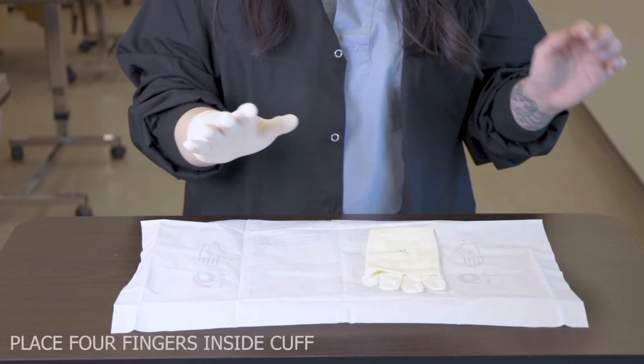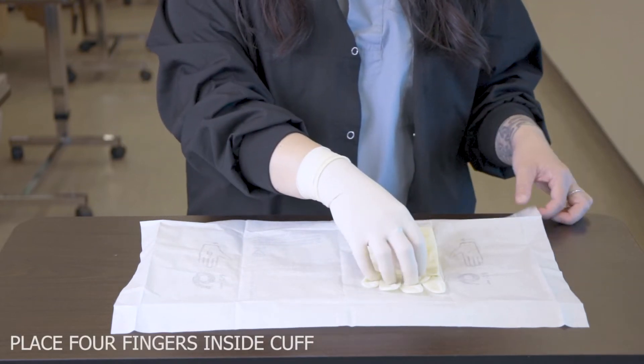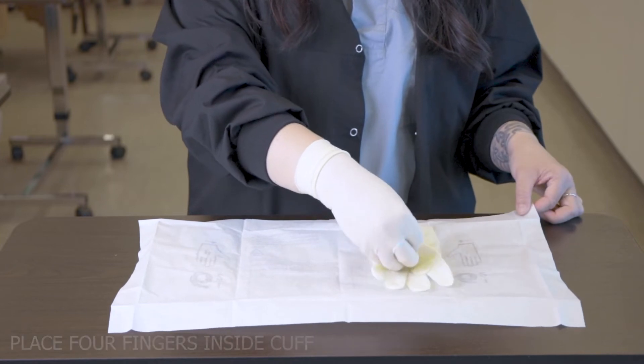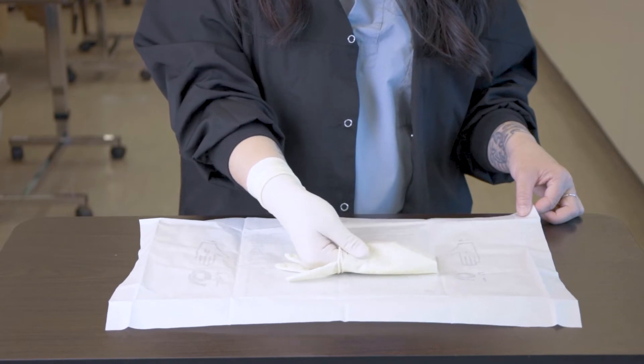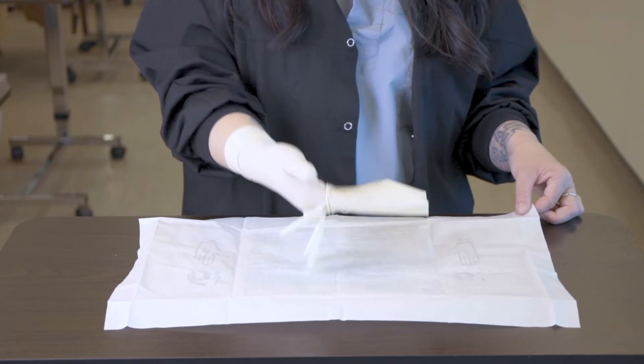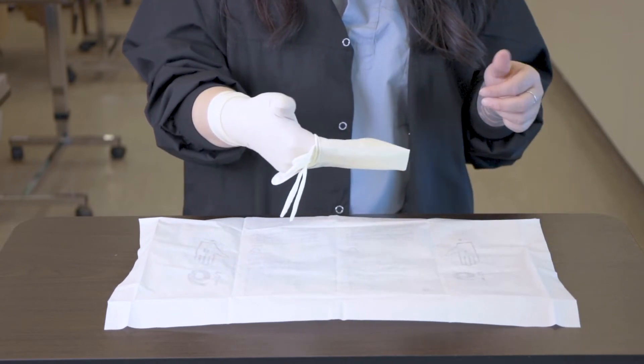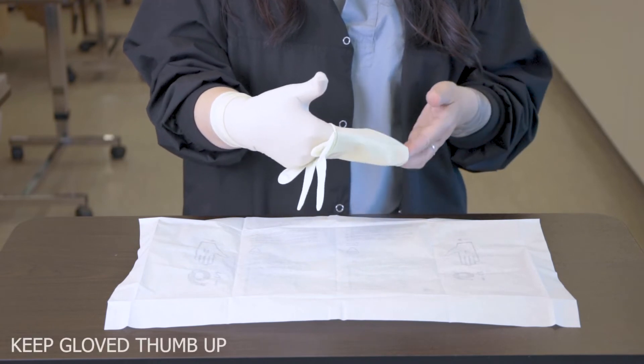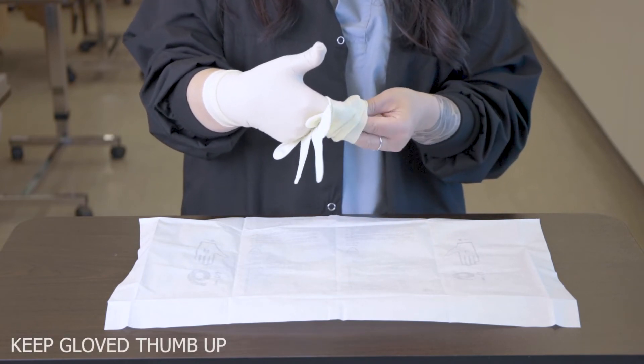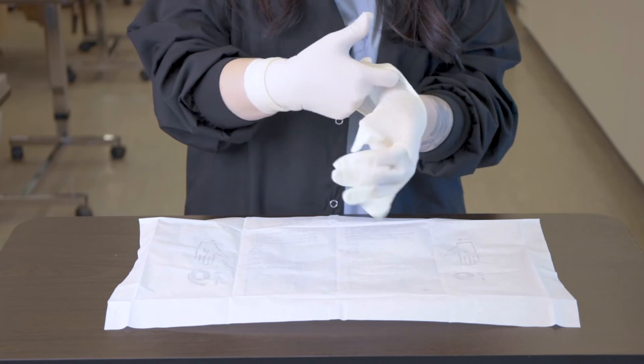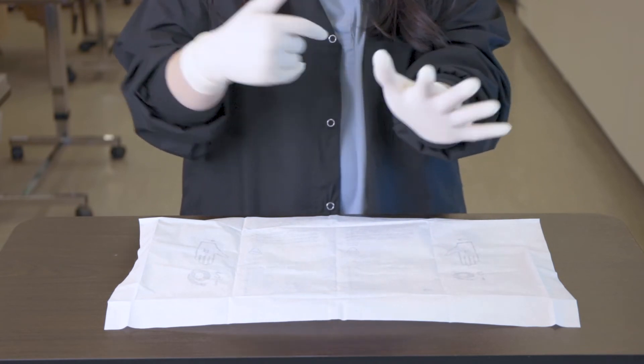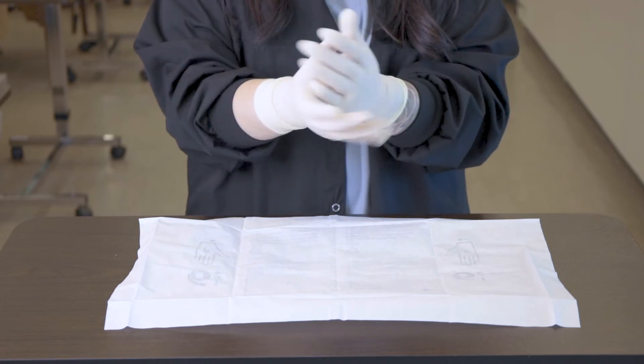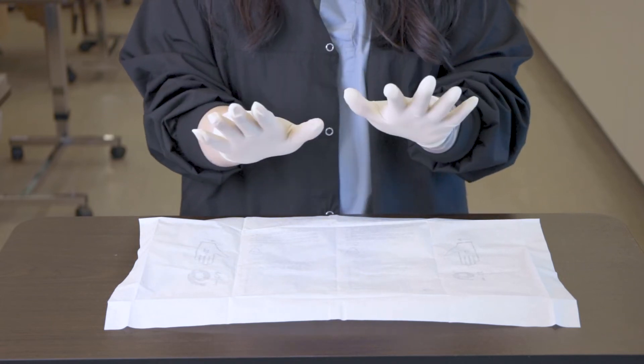Now I'm going to take my gloved right hand and place my four fingers inside the cuff of the left glove, and I'm using my left fingers to stabilize my field at the one inch border. I also turned the glove horizontally to allow me some space, and I picked up the glove from the field, kept my right thumb up to avoid contamination. I'm also making sure that my hands are away from my face and chest and the table, and adjusted the glove as necessary.